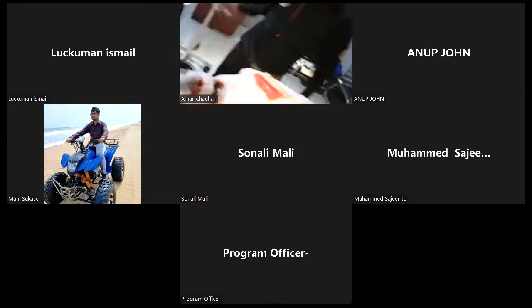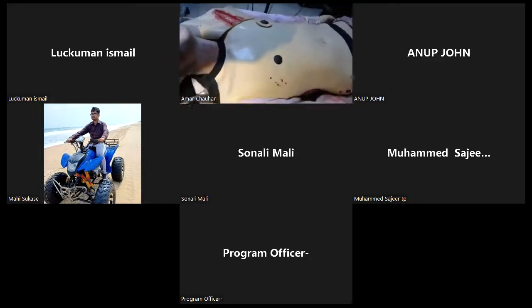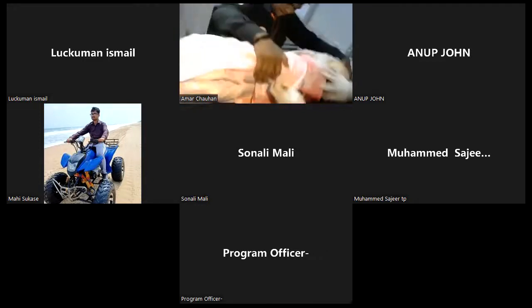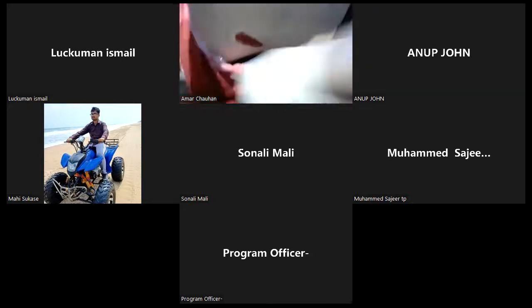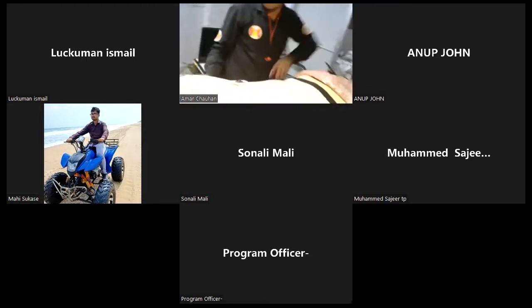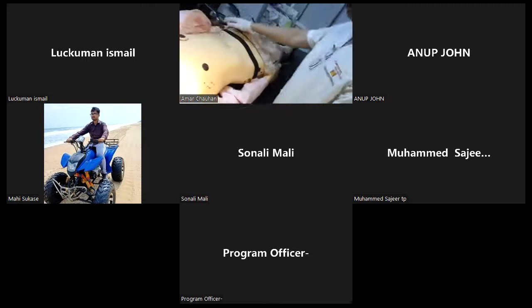Okay. Now moving to E. Then you do the log roll, and you will see the hidden injury at the back of the patient. Can you see, man? Yes, sir. So this is a hidden injury. Just to emphasize the point that whenever indicated, one should do the log roll. So these are the various features in our Moulage patient.